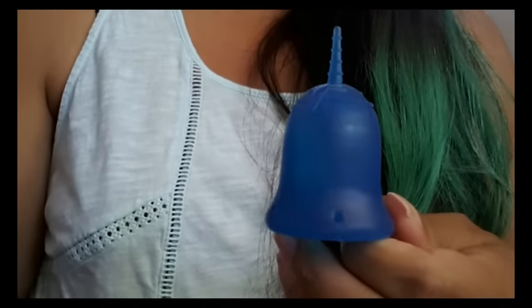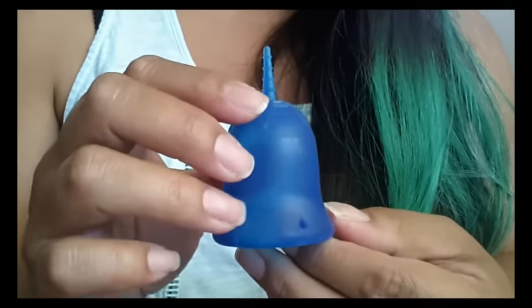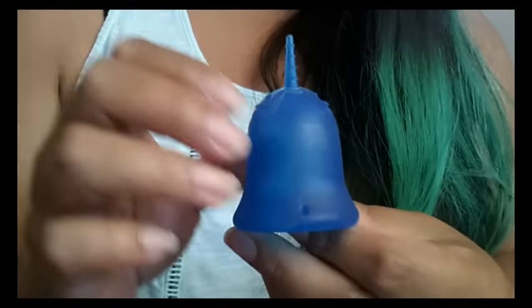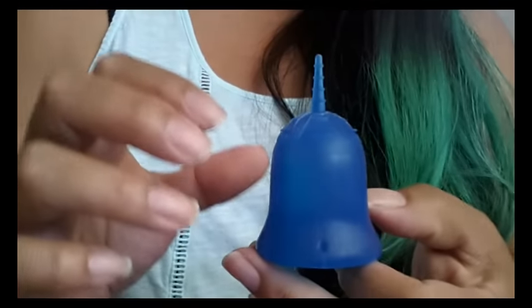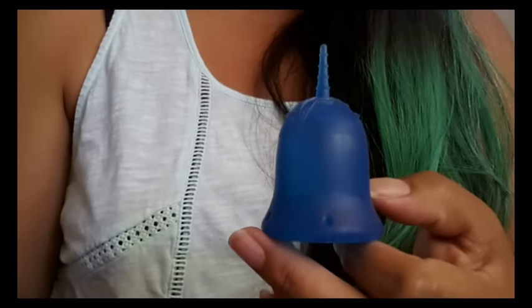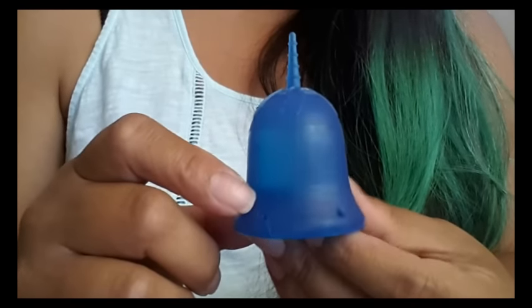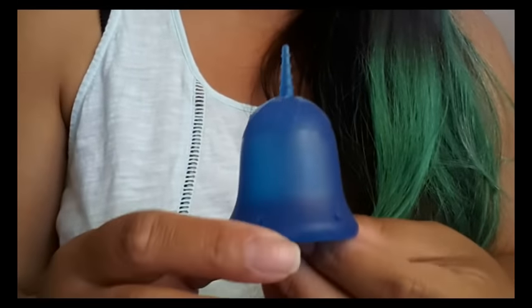They also come in six different colors. I don't have the color list with me but I think this one is Meditation. I really wanted the Harmony, which is the aqua color. They do offer different sets on their website. I'm not sure if the cup comes with a pouch or not, but you can get it with the pouch, and also with one of their organic reusable pads. They also offer the pads on their own, as well as panties and extra little carrying pouches for the cups.